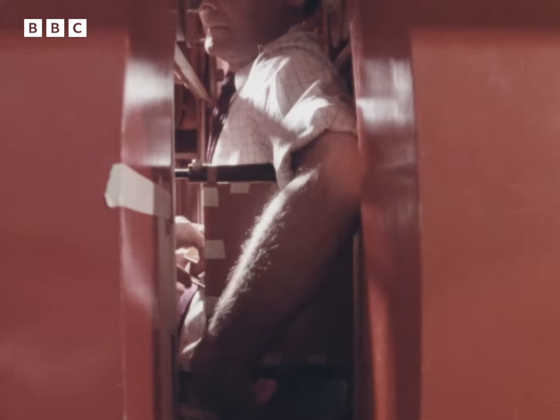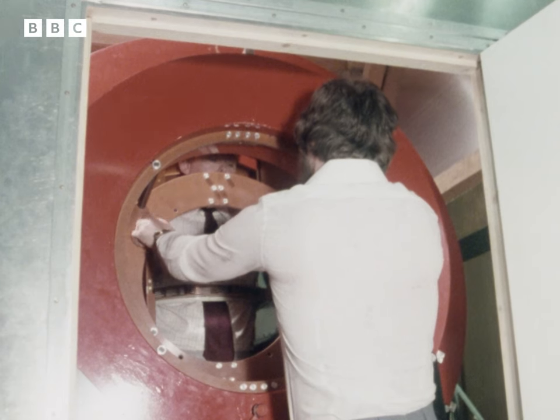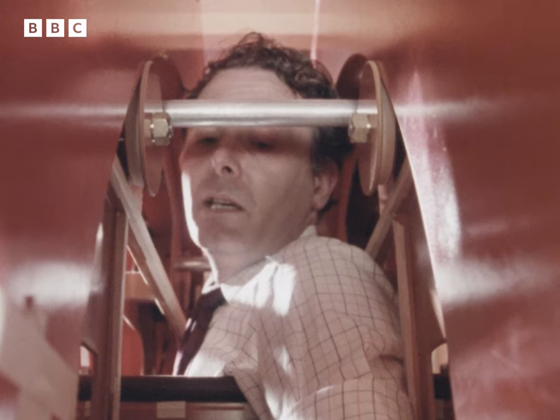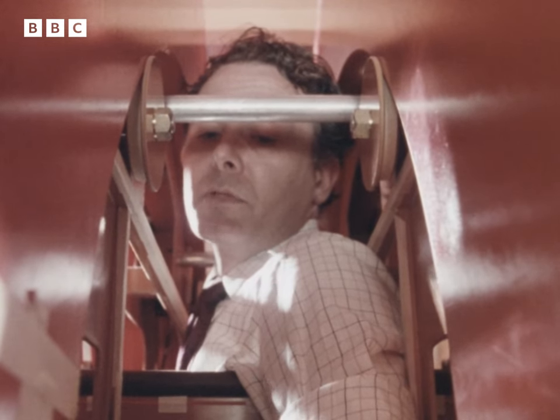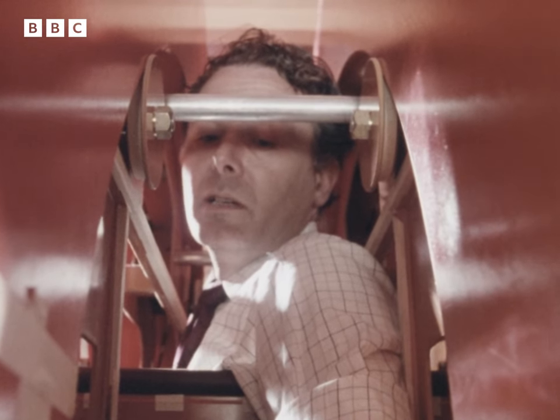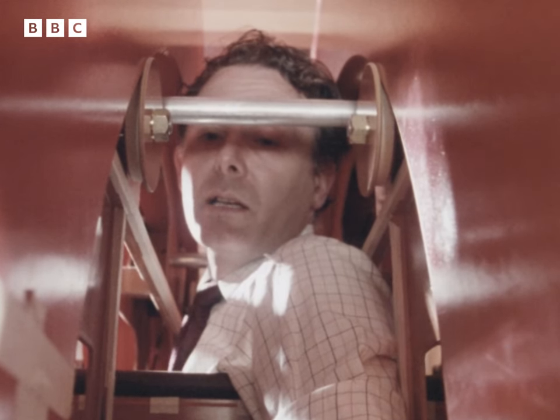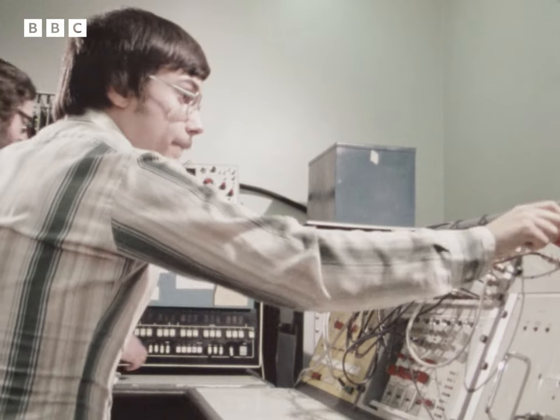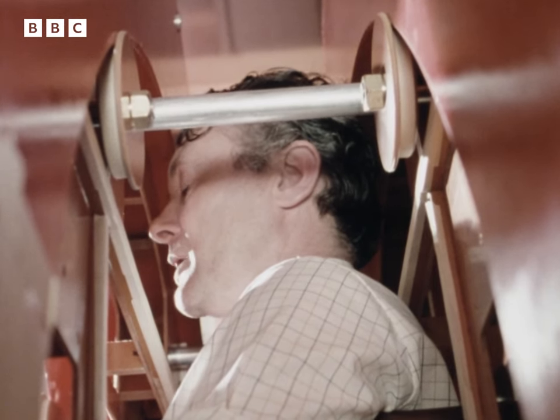In new experiments of this type, one can never be 100% sure that there won't be any adverse effects. The worst thing that could have happened would be a cardiac arrest, so that when the button was pressed, I would have either had an immediate cardiac arrest. If that didn't happen, then I was fairly certain that things were okay. Press the switch and let's go.